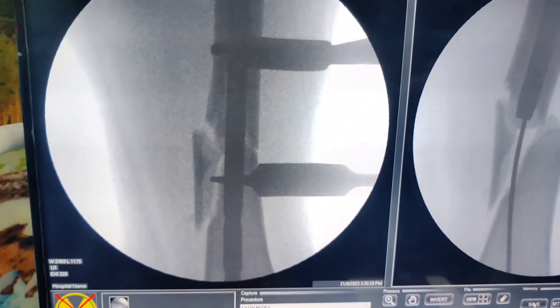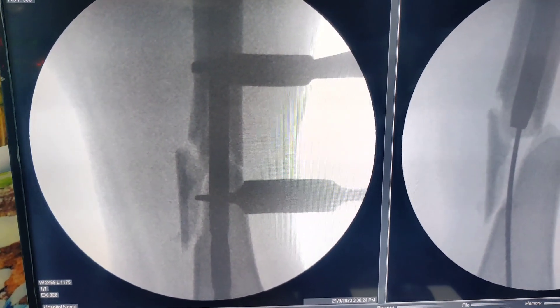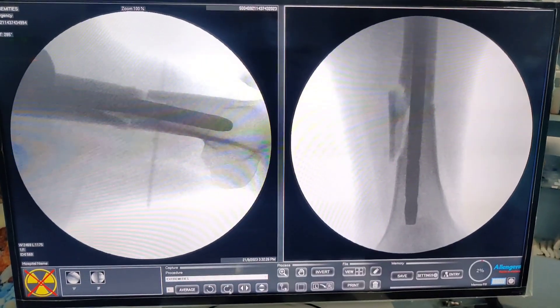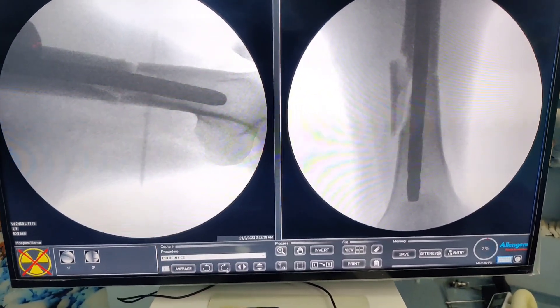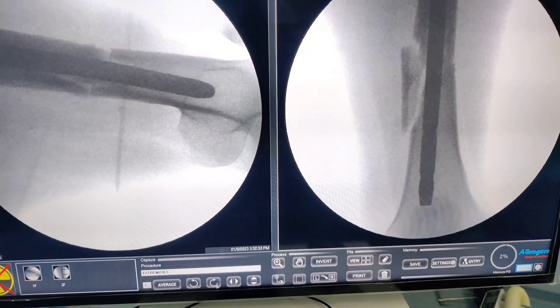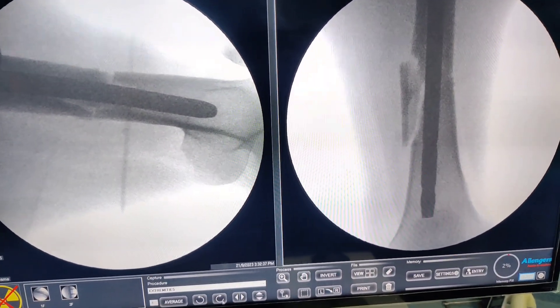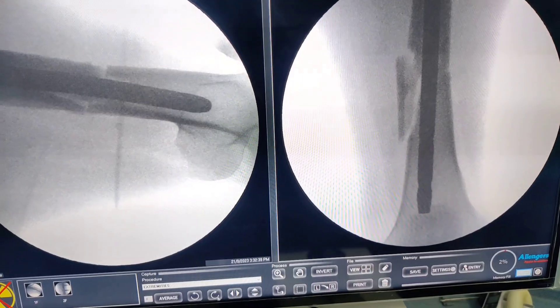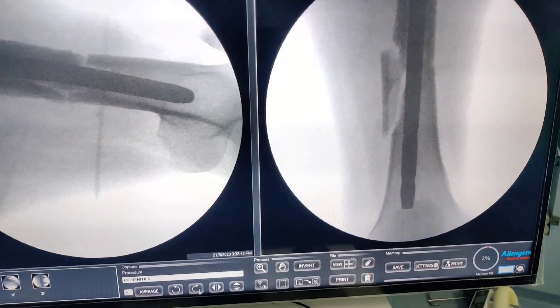Look at this reduction — it is perfectly anatomical. The nail could be slightly more central but I think it will do the job. AP and lateral the fracture is nicely reduced. If you are struggling, do not struggle for too long — make two stab holes and your life will be far easier.